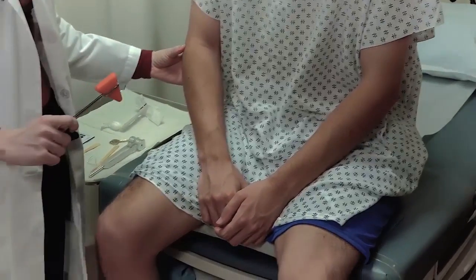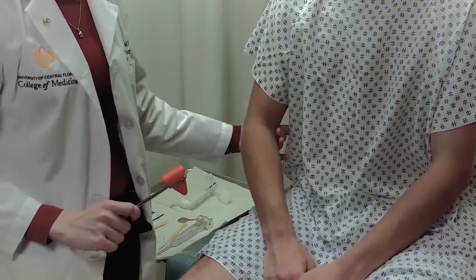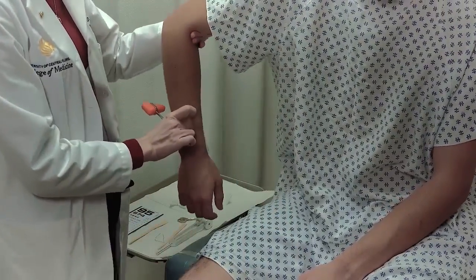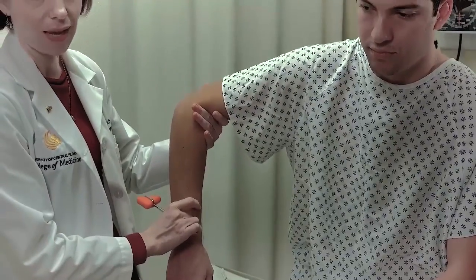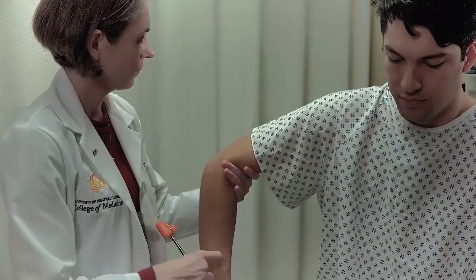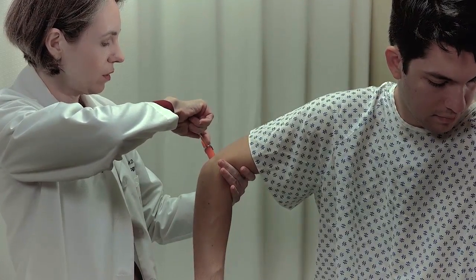We also want to perform the triceps reflex. For the triceps reflex, the arm needs to be relaxed but the tendon also under some stretch, so the arm needs to be bent. Generally, we'll hold the patient's arm out to the side with the arm bent, supporting as much of the weight as possible, and then strike the triceps tendon directly with the reflex hammer.